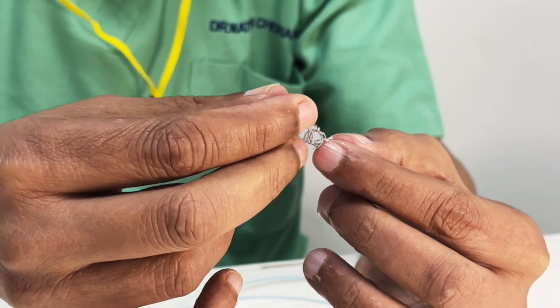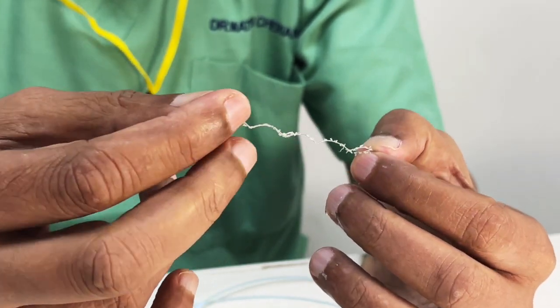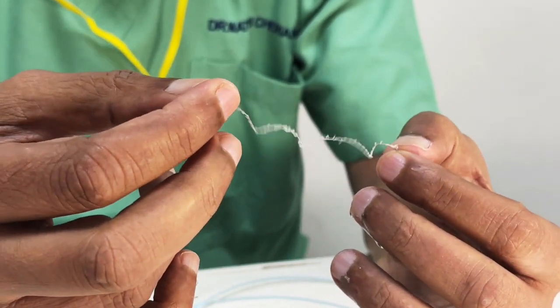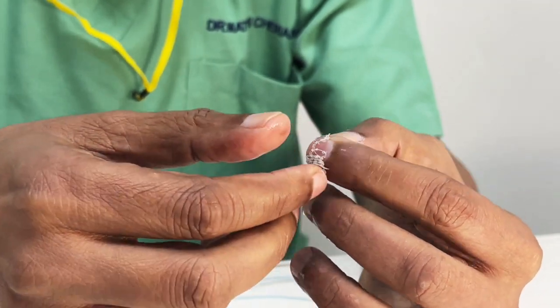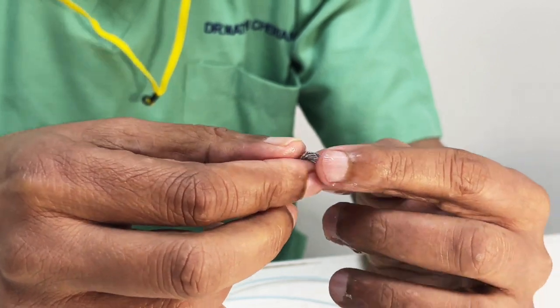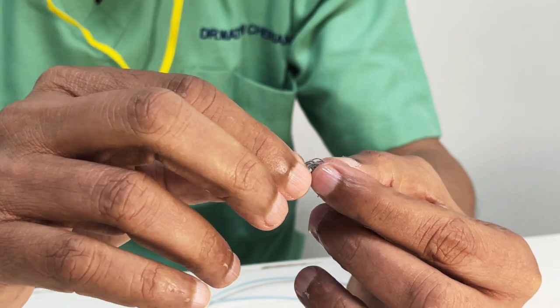So remember again, sizing is 1 millimeter diameter more. If you can enter into a side branch, anchor it. You can do two techniques. One is pushing with the micro, or second is injecting it. Injecting works very, very well, and especially if you have already got a basket or a clump of coil made. After that, you can inject rapidly and complete the process.